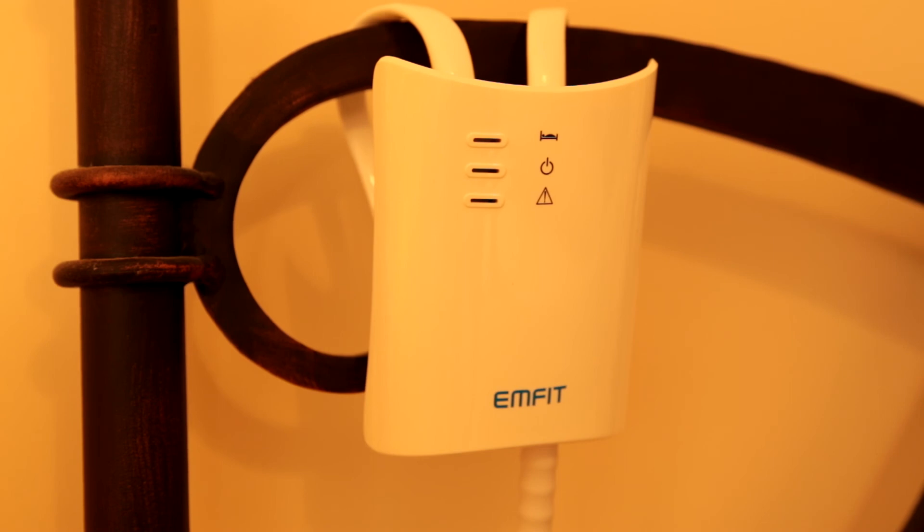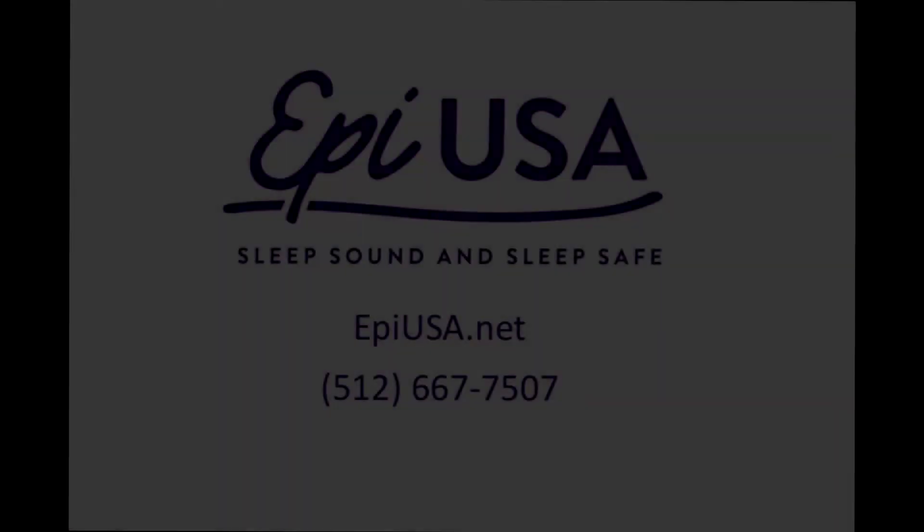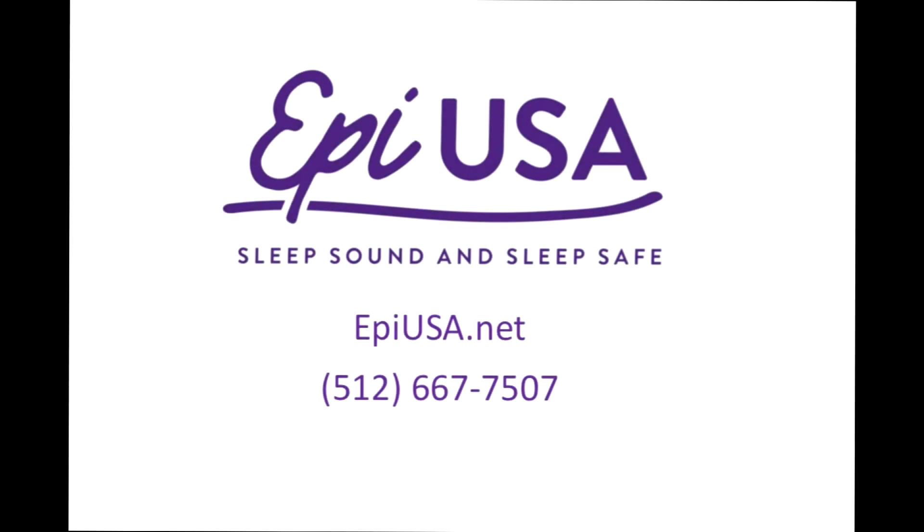Keep pressing at that speed until the alarm sounds. This should be just past the preset delay you've selected. You're all set! And if you have any questions, we always encourage families to contact our office for assistance at 512-667-7507.